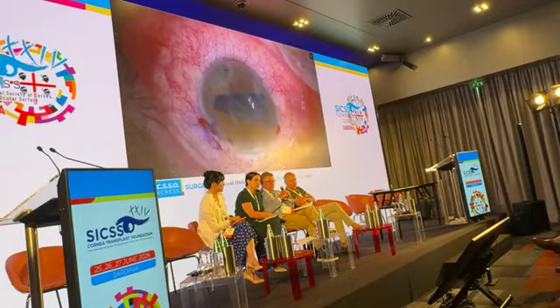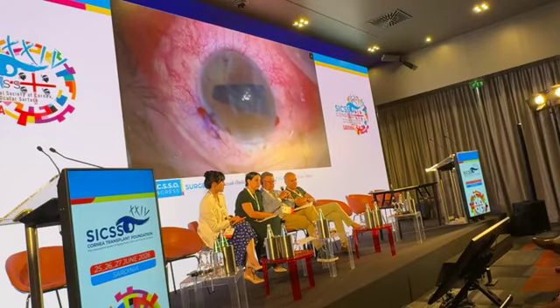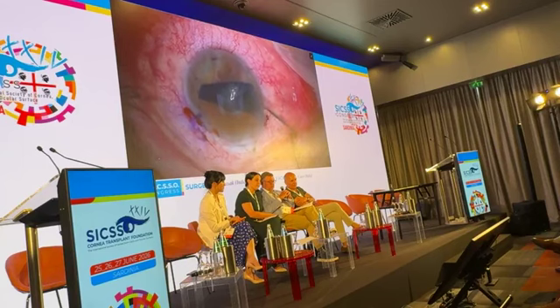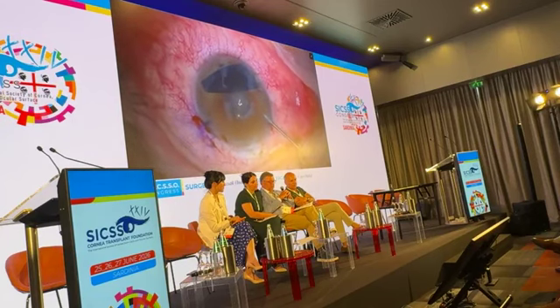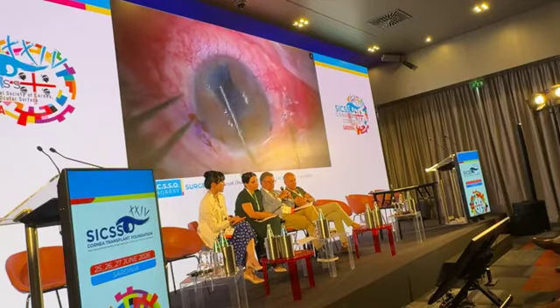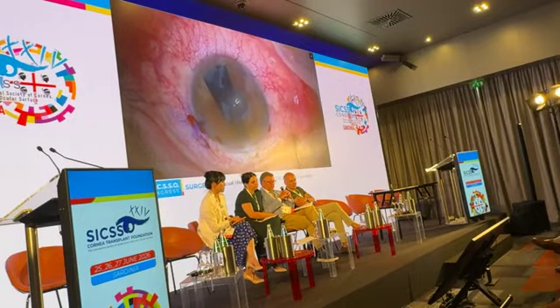The injector is 2.8 millimeter. So that's why we can go in easily. 2.8 millimeter the injector and 3 millimeter the wound. And the patient had preoperatively an anterior chamber depth, I remind you, of 2.83 millimeter. Now the graft is well stained. It's in the anterior chamber.